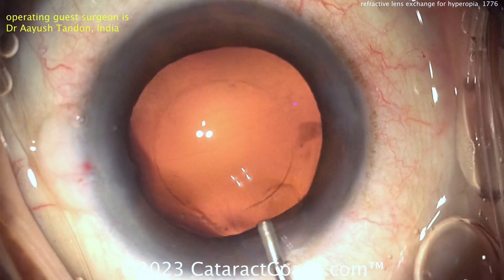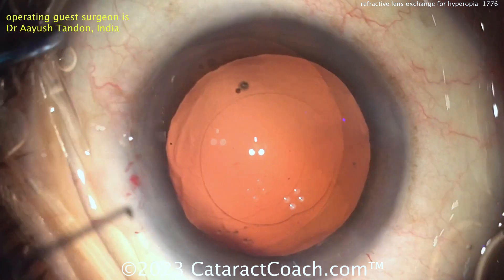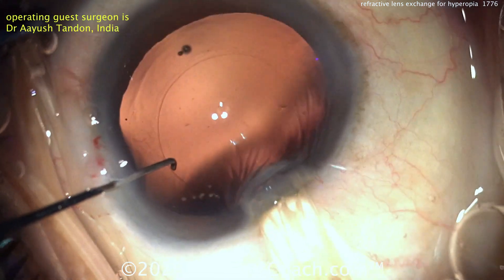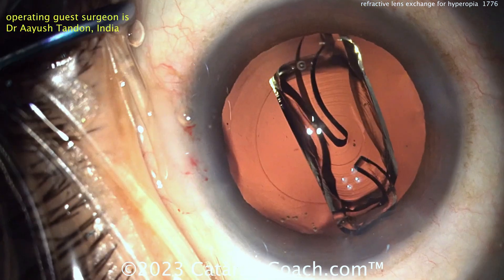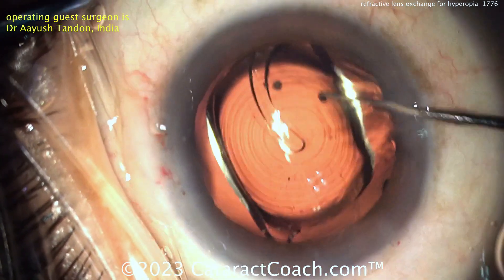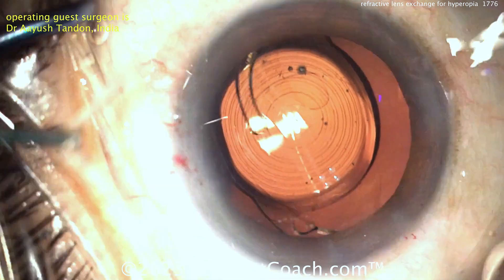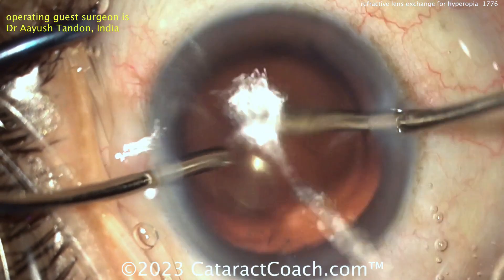Nice-looking rhexis, beautifully centered. Here comes the viscoelastic to fill the capsular bag — let's get the lens in. These cases are fun to do; the video has obviously been edited but we want to show you the whole case. Delivering the lens nice and easy — this is the Johnson & Johnson Tecnis Synergy lens, looks like a non-toric version. Getting that in the capsular bag. Perhaps this patient, like typical patients over age 60, has a little bit of against-the-rule astigmatism, and therefore this phaco incision at the 180 mark can help to neutralize that.